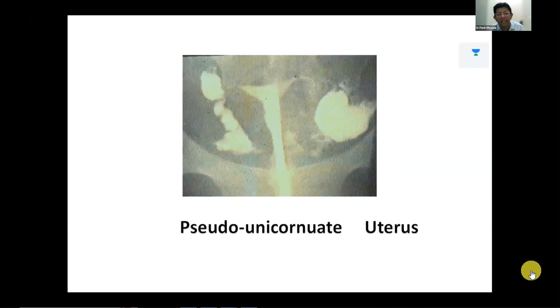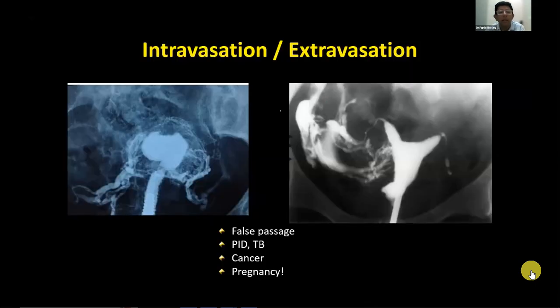Again, if you see half of the uterus, instead of the normal triangle, there are all the adhesions over here. So it's very difficult to say, but again, this is a hydrosalpinx over here, this is a hydrosalpinx. So all these are very classical findings which you get in genital tuberculosis. And of course we should also know the intravasation of the dye, which could be a feature.